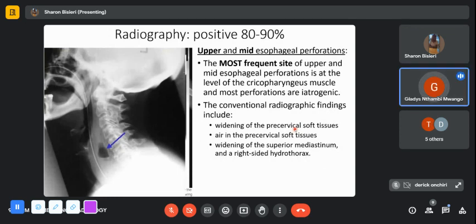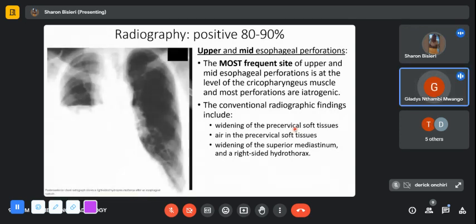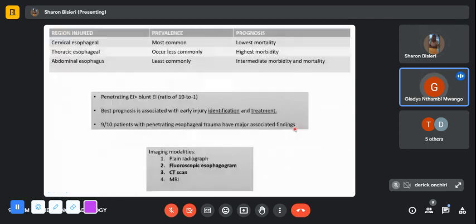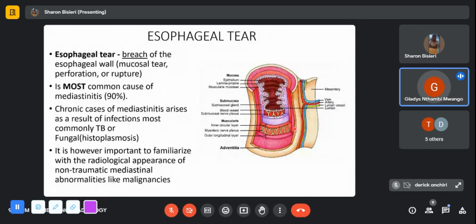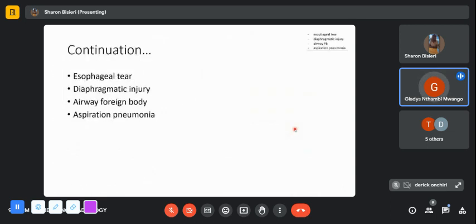It's actually to do with radiation protection, reducing the radiation dose. If one can pick the abnormality in one view, usually the frontal PA or AP, then you don't need a lateral view. But when you see something on an AP or PA and you want to look at it further, then you ask for a lateral view.